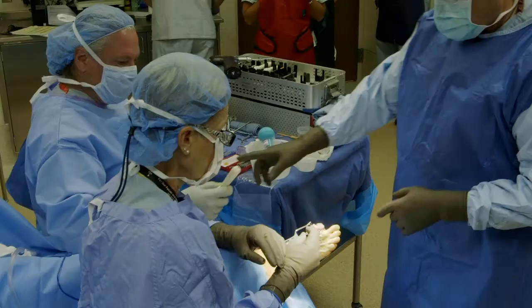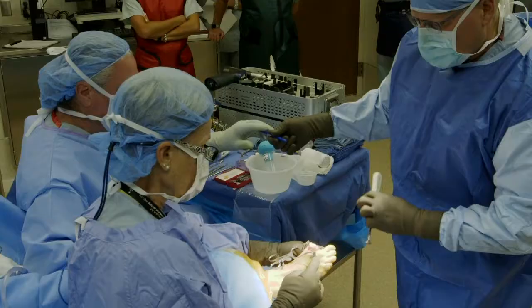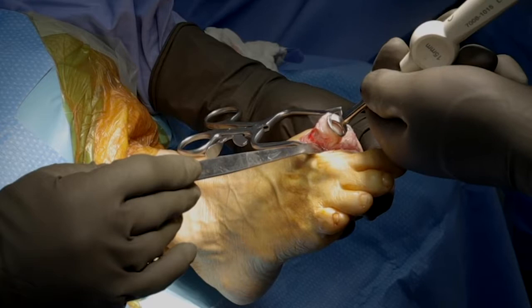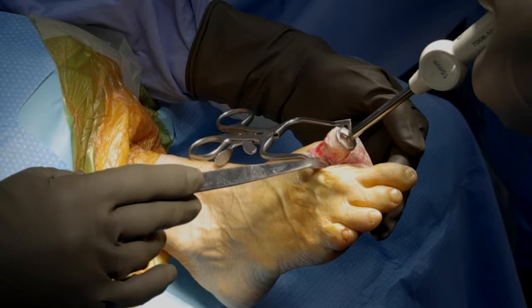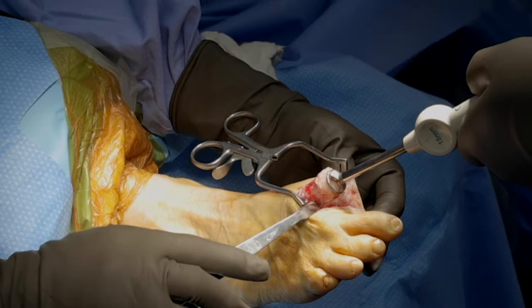This is your guide — your footprint. This is going to be exactly the surface area that the implant is going to cover. I put my footprint down so that when I set it there, that's where my implant is going to sit. I hold that there first and then take the guide pin and put it down through. That confirms that's right where I want to be. Now I have exactly where I want to be. Lori helps me by basically confirming I'm going down the shaft of the metatarsal, so now I know where my footprint is sitting and my guide pin is going to go right down the shaft.